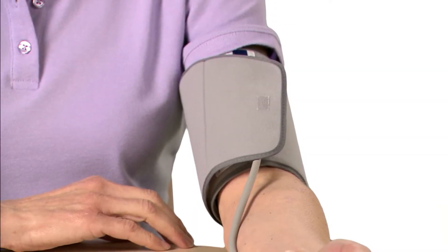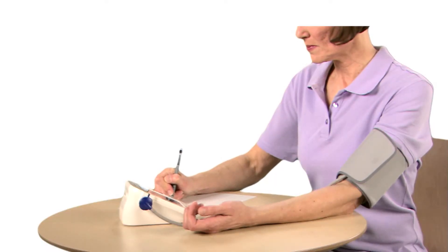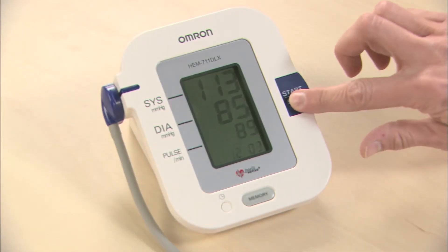The cuff will inflate automatically. Hold still until the cuff deflates and your results are displayed. Make sure to record your reading. Press stop-start to turn off the monitor.